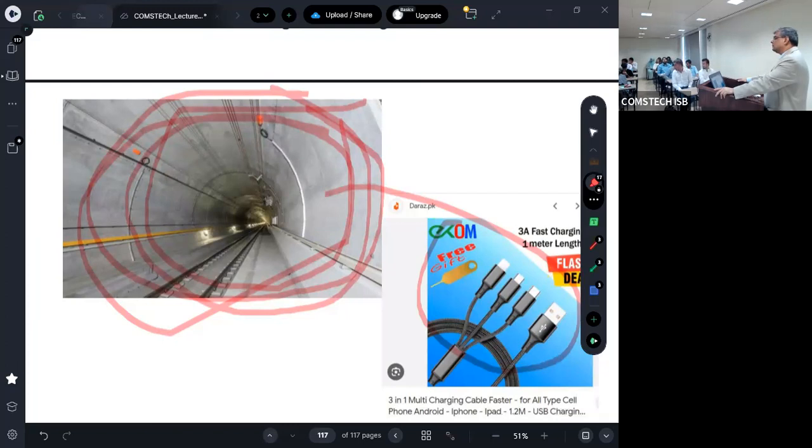Can we use a glucose device for monitoring? Yes, we measure the glucose with a glucometer. Initially, during checking, we made a small prick in the tail, which gives blood. Many people don't know there is also an option in the ear: make a little prick to get a little bit of blood.